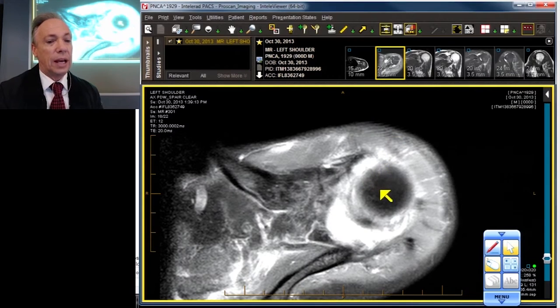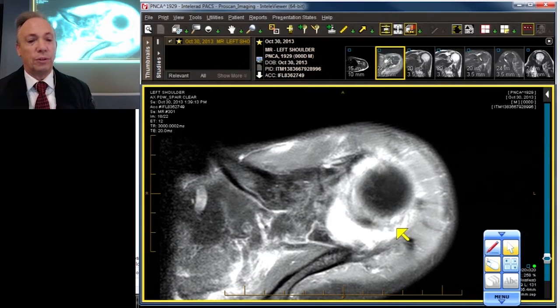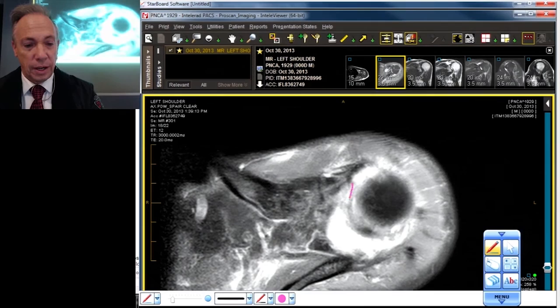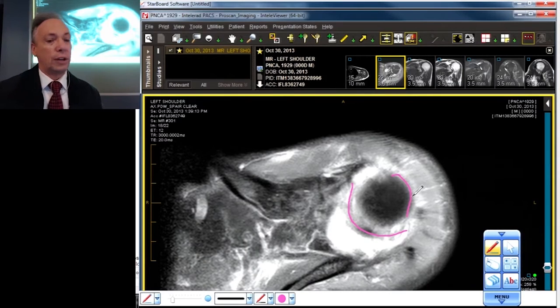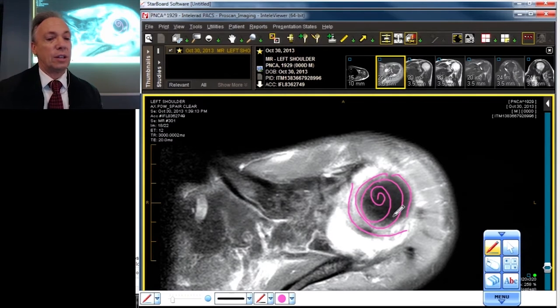We start up high in the axial projection and we see a giant curvilinear crescent right here. It's so beautiful I've got to put some colors on it. All of those structures should be over here peripherally on the humeral head. This is a giant hole right here. Of course everybody forgets to look at the poor axial projection.